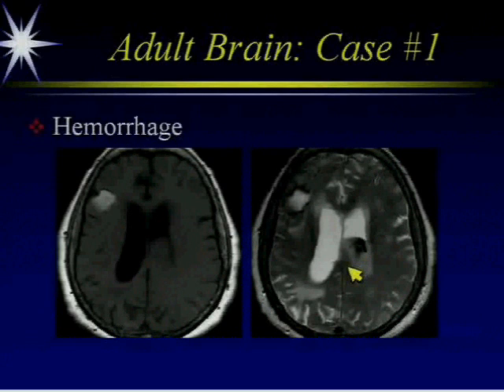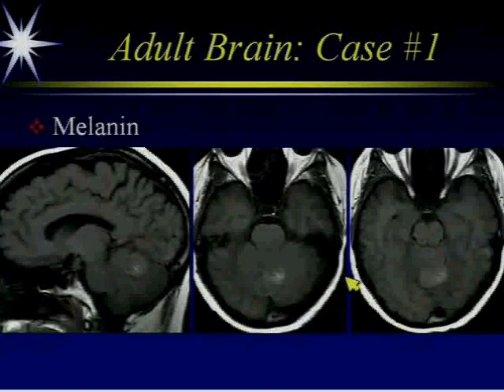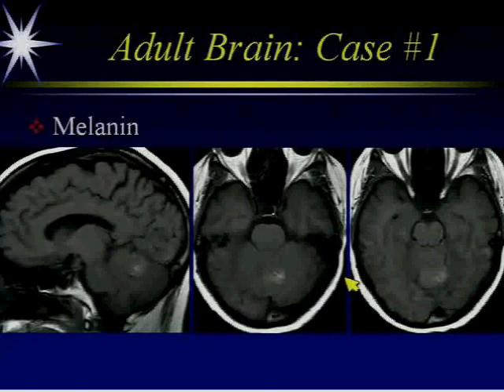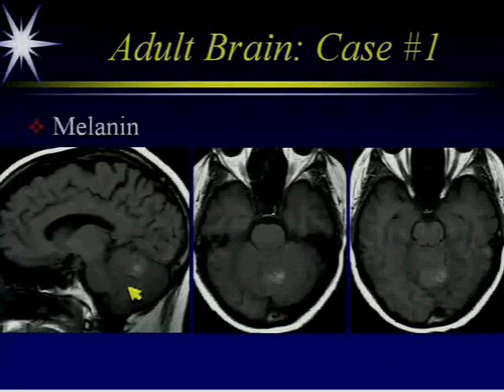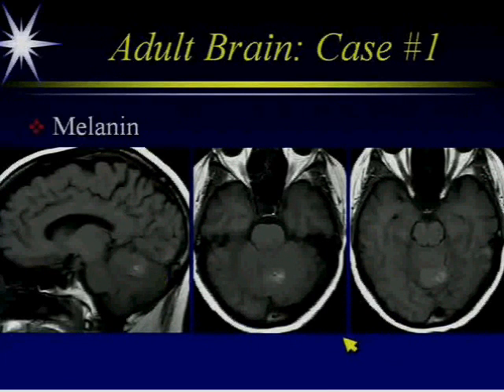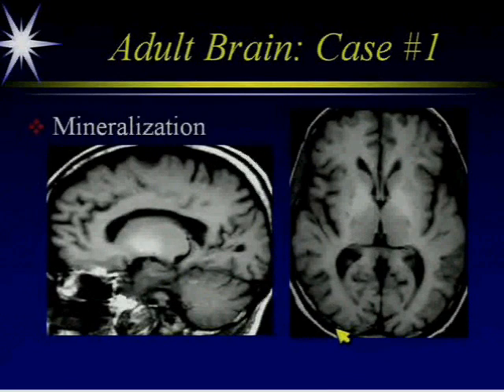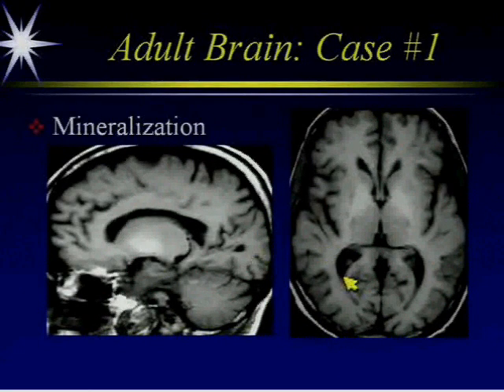Mineralization can also be bright on T1. We can see this bright signal in the basal ganglia, which can be due to calcification in conditions such as hyperparathyroidism, pseudohypoparathyroidism, or hypoparathyroidism. It can also be bright due to manganese deposition, which you can get in total parenteral nutrition administration or in liver failure.